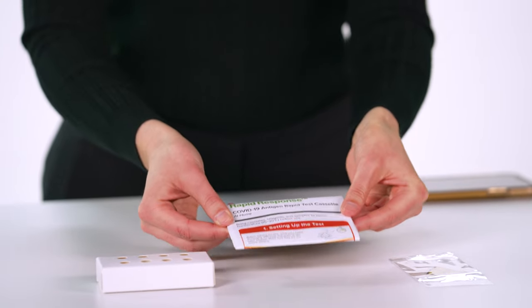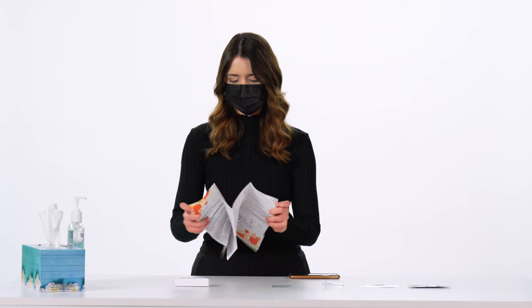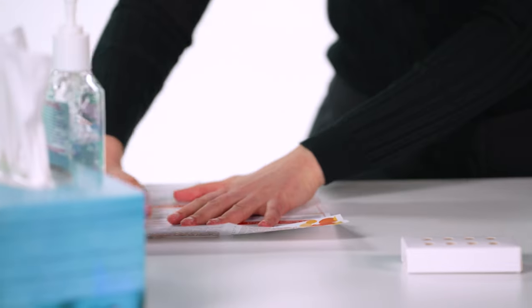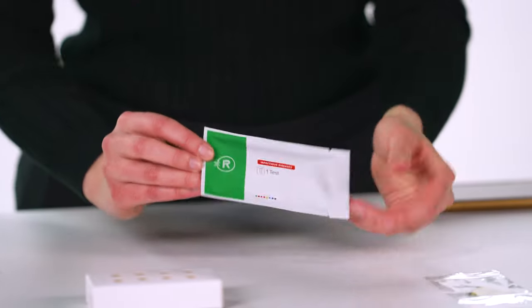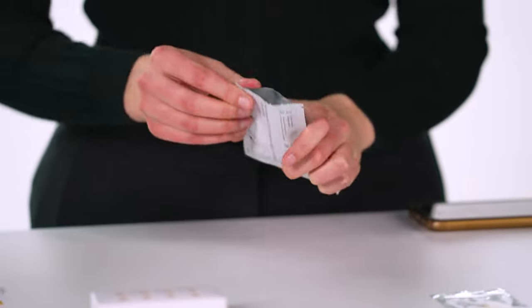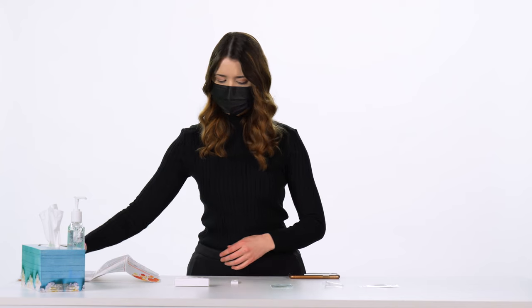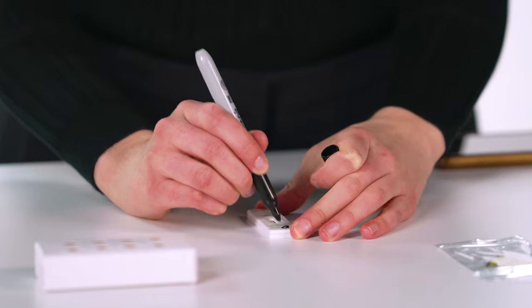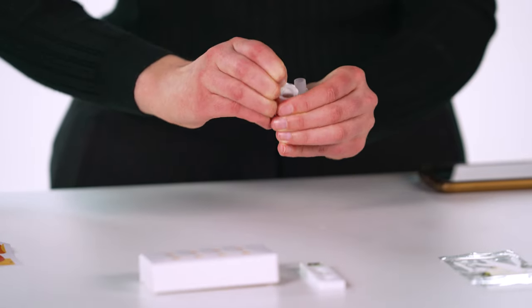Read the instructions carefully before starting the test. Begin by opening the pouch and removing the test cassette. Place the cassette on a clean, level surface. Label the test cassette for the person who is being tested. Peel back the foil seal from the top of the extraction buffer tube and place it upright in the tube stand.